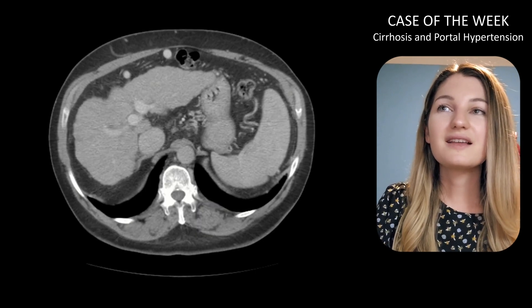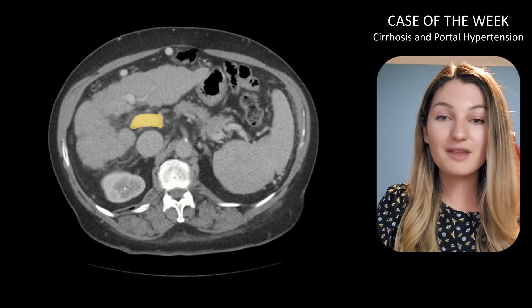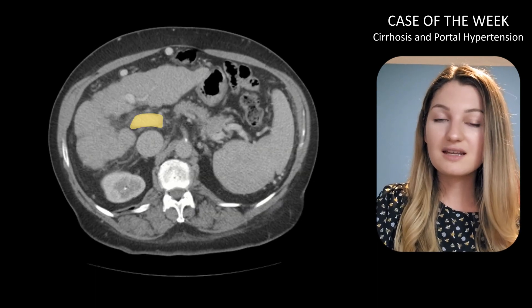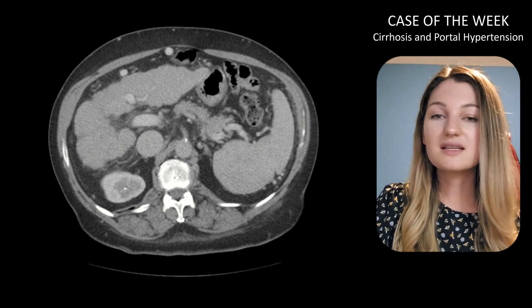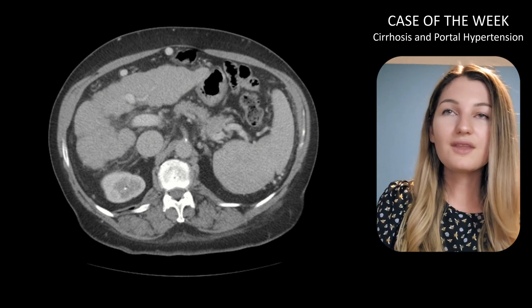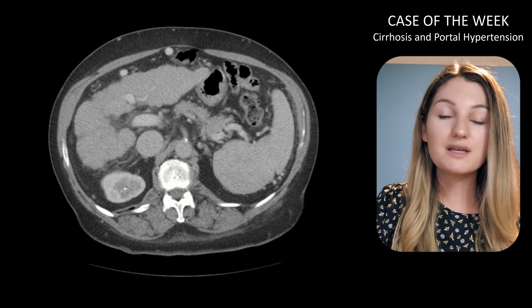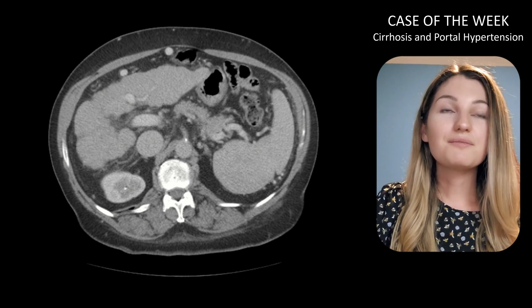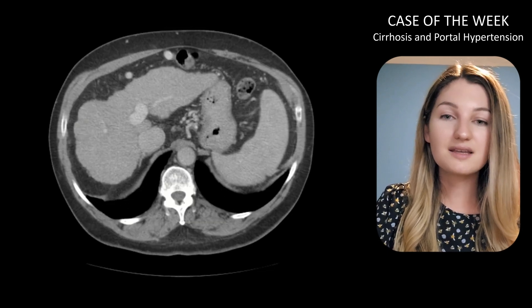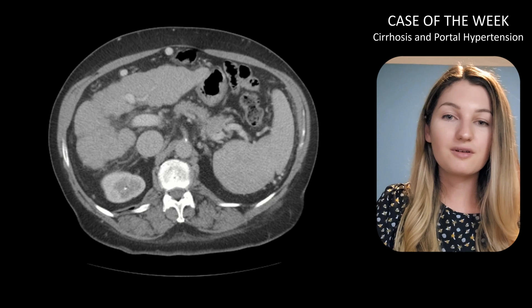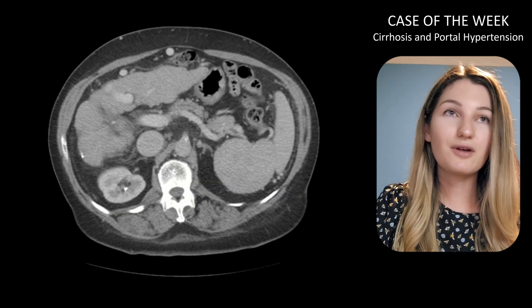Next let's take a look at our portal veins. Our main portal vein is looking a little bit thick, and it measures 16 millimeters in diameter — the upper limit of normal is 15 millimeters — so this is consistent with portal hypertension. While looking at our portal vein, let's make sure we don't have any evidence of thrombus. We can have bland thrombus or tumor thrombus, so if you see any thrombus, check for abnormal enhancement that could indicate tumor thrombus.